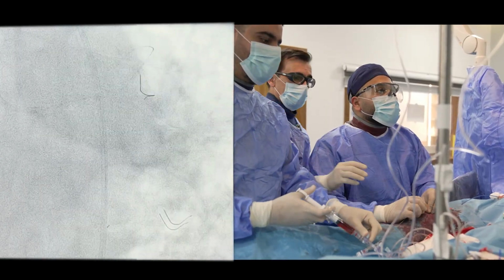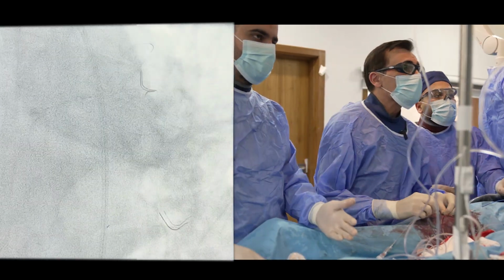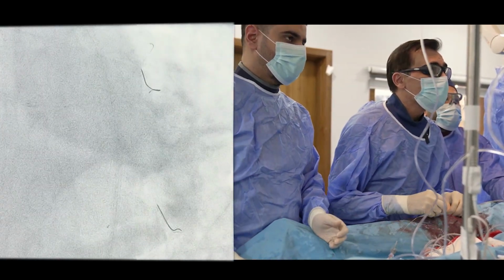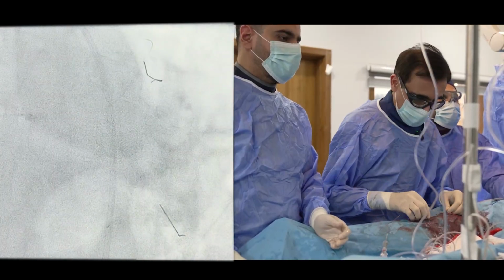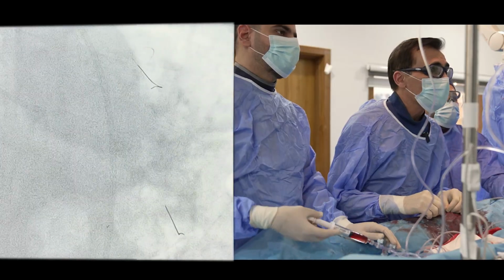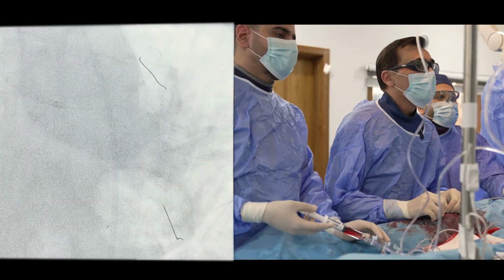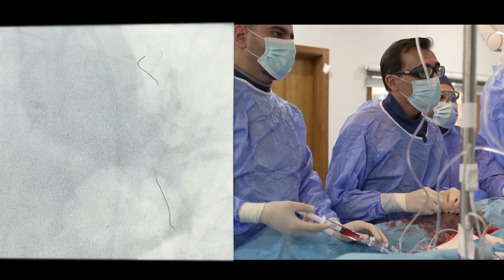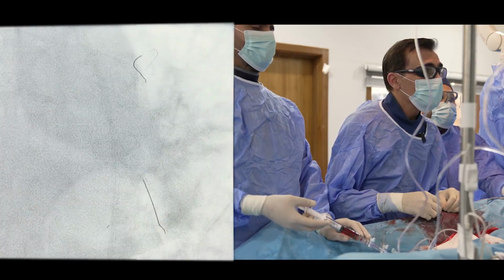Sure, let me see. So it's not easy to pass the Wolverine into the mid-circ, I think, the mid-left main stem. Okay, let's see if we have intermingled wires. Yeah, most probably. Yeah, mostly the wires are intermingled here.